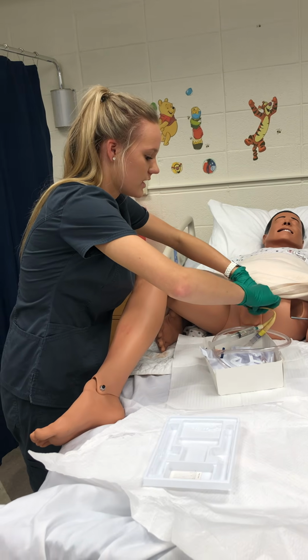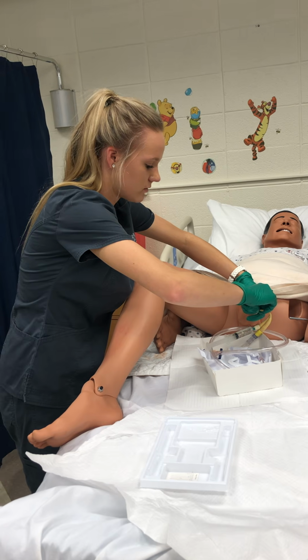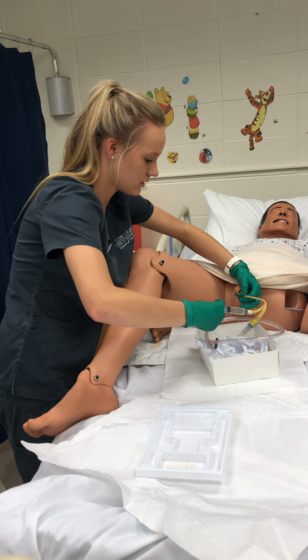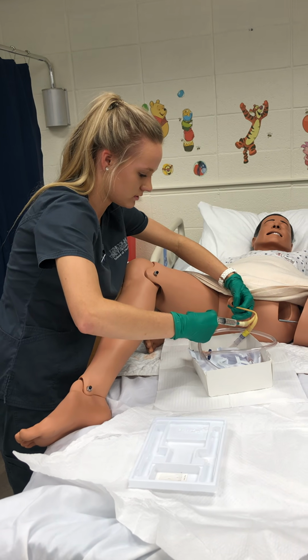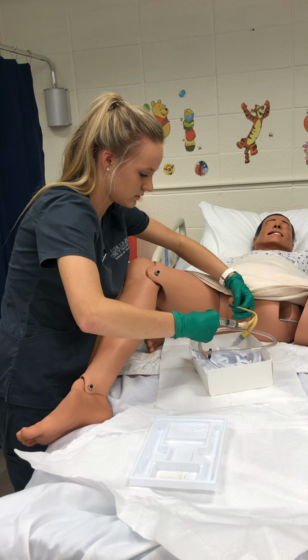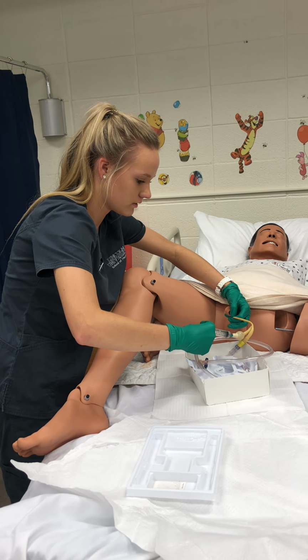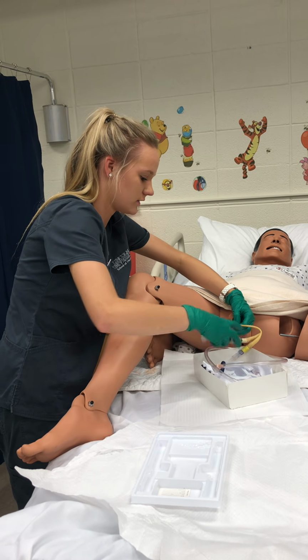And then whenever I get there, I'm going to take my non-sterile hand and hold it 1 inch from the site, and I'm going to inflate the balloon. So my syringe, the protocol is 10, so that's good. We have 10.